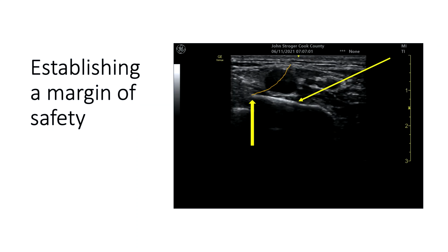So you have a very narrow window of opportunity in the supraclavicular block. And that is one of the main drawbacks of this block. If you are unable to drive a needle to this flat image, then you should think about doing some other technique, not necessarily this one.